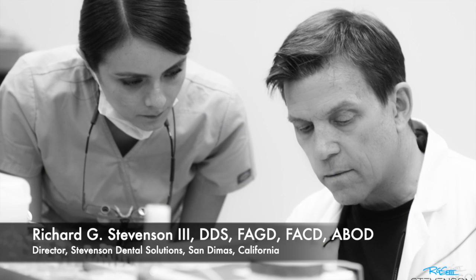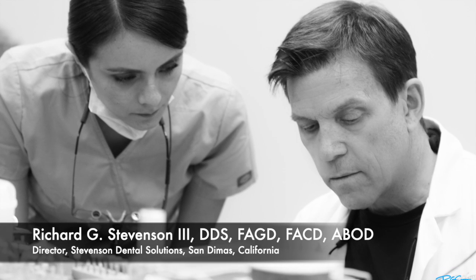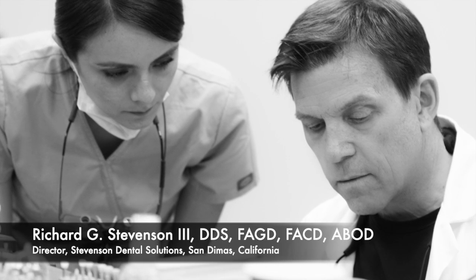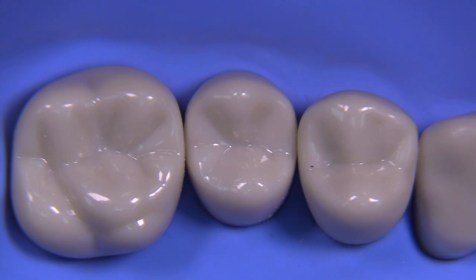Hi everybody, I'm Dr. Richard Stevenson and I'm the director of Stevenson Dental Solutions, a training center for dentists to teach you how to improve your hand skills and your knowledge in general dentistry. We're in San Dimas, California and today we're going to talk about the class 2 prep with just two burrs.